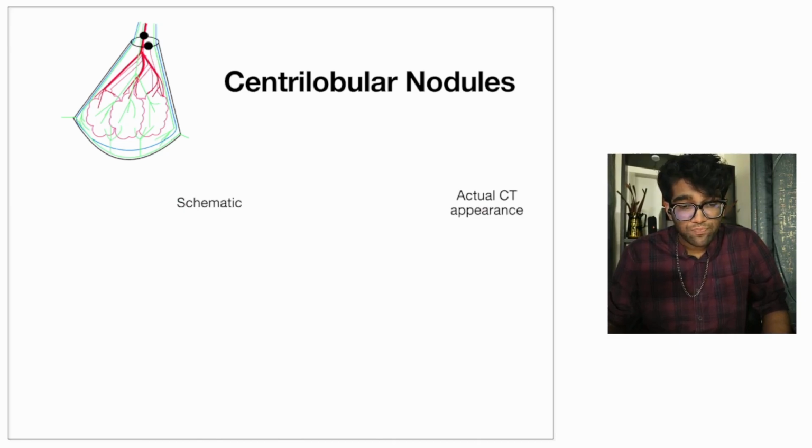Now similarly, because the conducting respiratory system is branching distally, you could have opacities along that branching as well, and these opacities could start to fuse with each other, to become continuous with each other, if it is an infection or some kind of neoplasm that is growing within the walls of the bronchioles. So they would tend to fuse with each other like this. Then we pass an X-ray beam through this structure, at 1 millimeter.